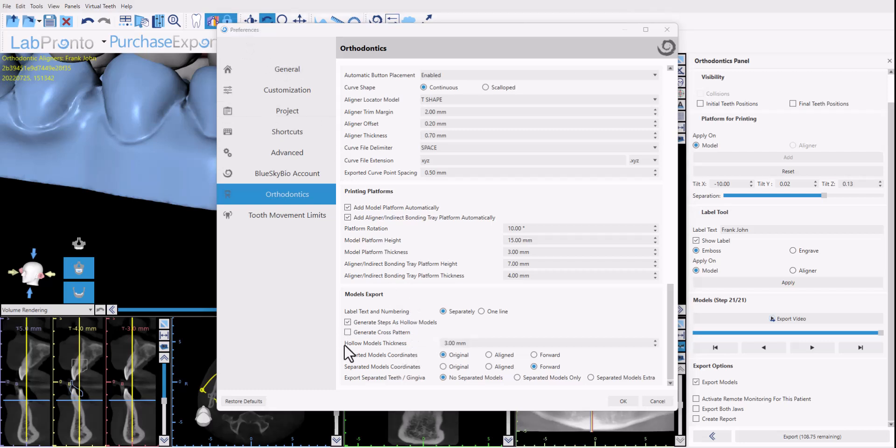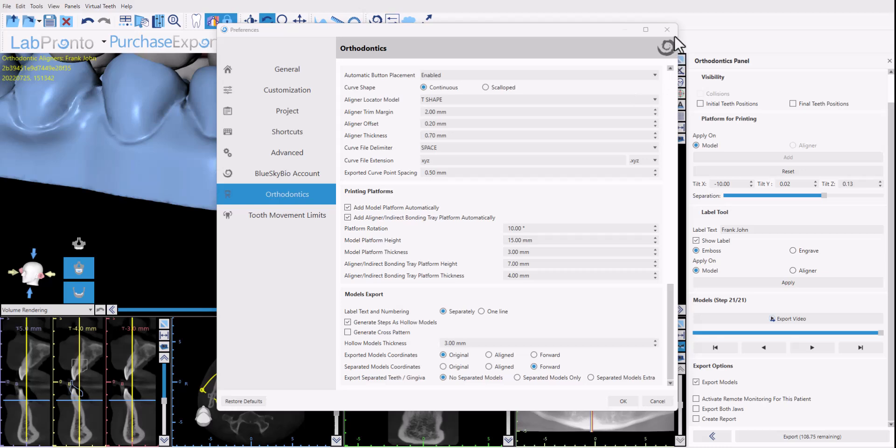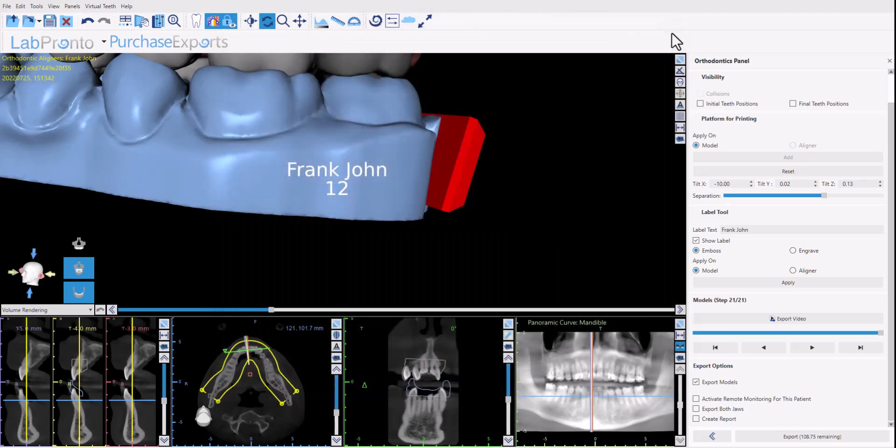We also have the option for hollow model thickness which is the minimum thickness for the hollow models, the minimum thickness of the material when it's being printed, so if you want to modify you could change that here as well. Okay I'm going to close this out.